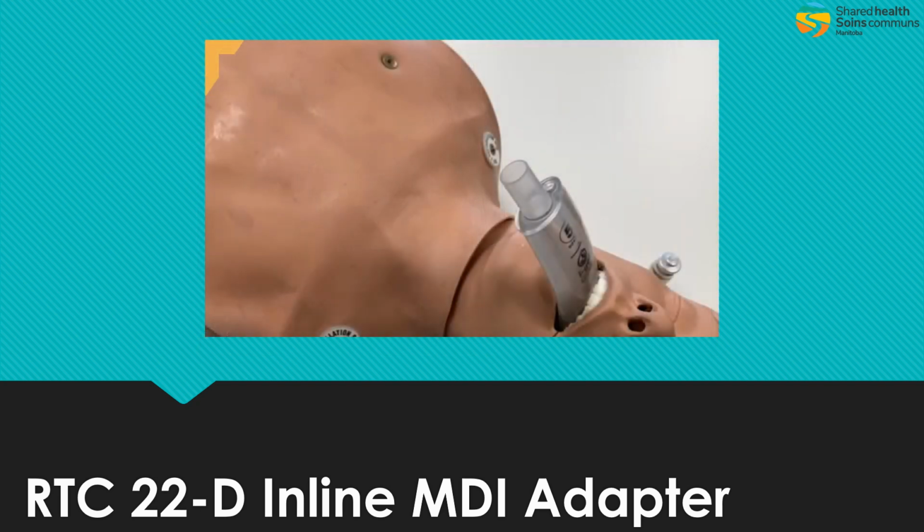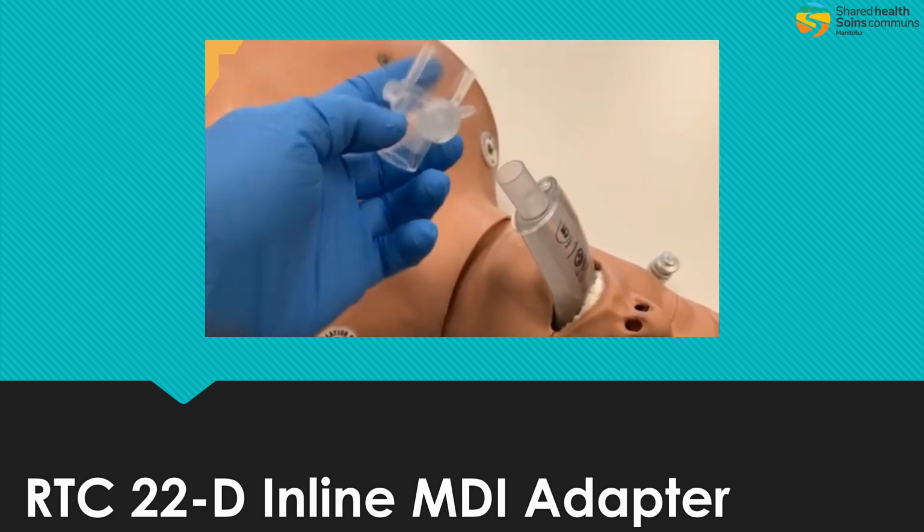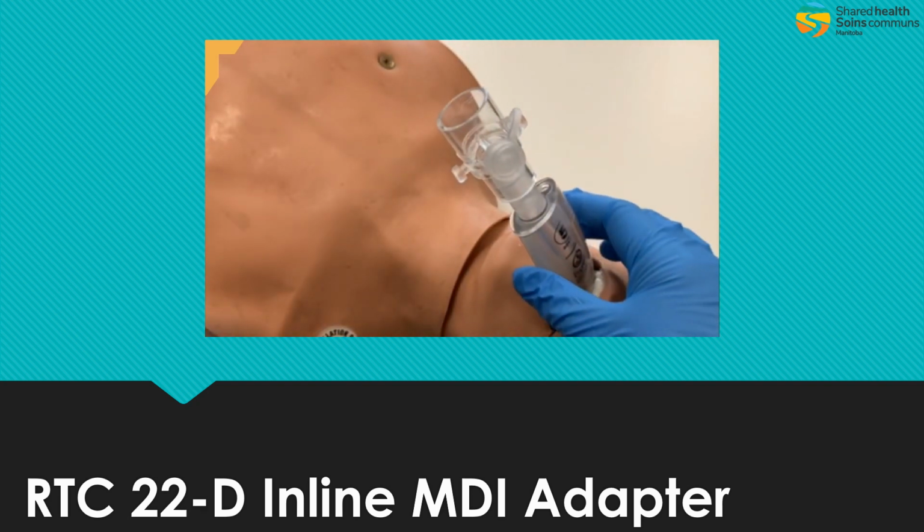Using an iGel, as you can see here, we're going to attach it to the iGel, but we want to make sure we're putting the correct end on. If we use the wrong end, it doesn't fit. If you're finding that's an issue, flip it over. Again, it's got that 15-millimeter adapter that fits nicely on our iGel.